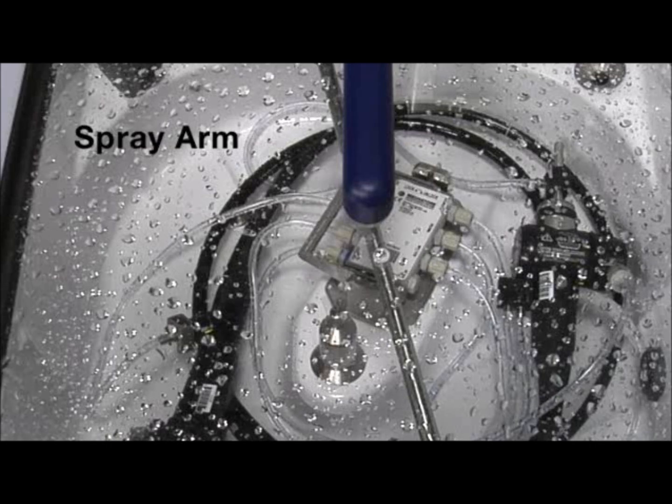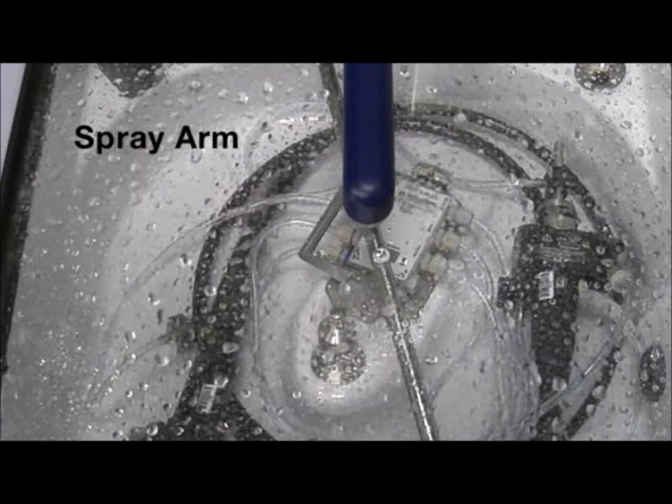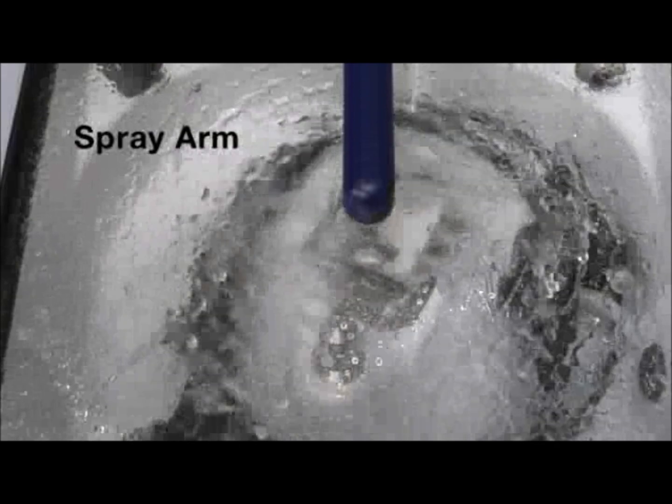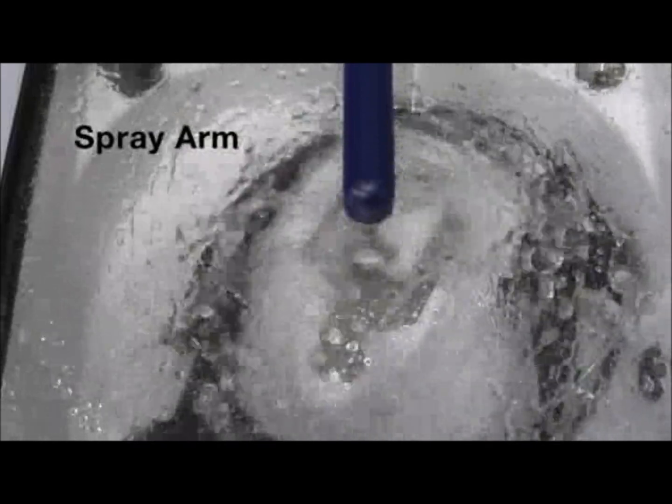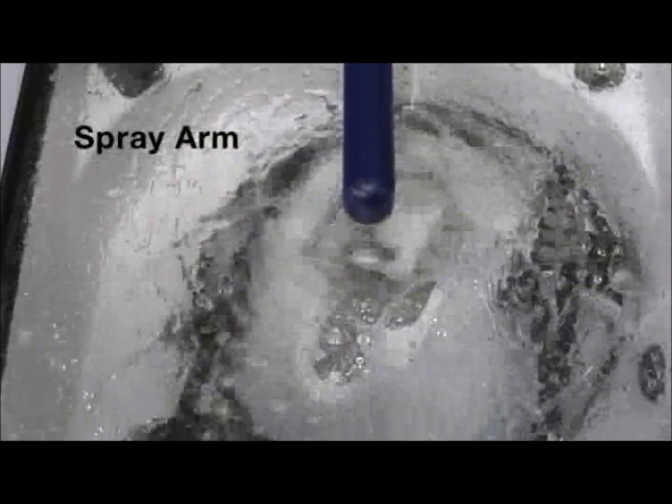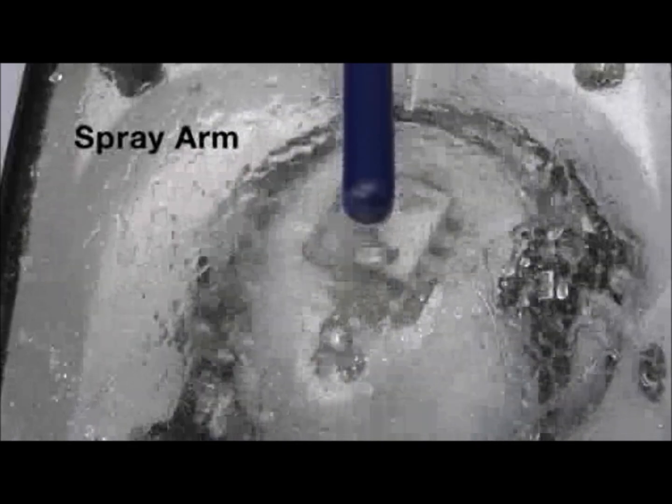The spray arm, located on the basin lid, provides fluid spray for disinfection and rinsing of the exterior surfaces of the endoscope. The use of the spray arm reduces the amount of fluids needed during the reprocessing cycle.